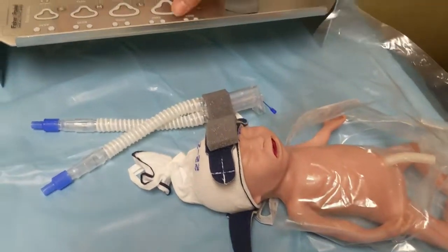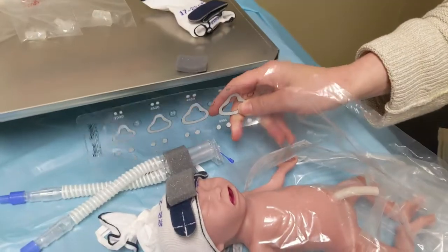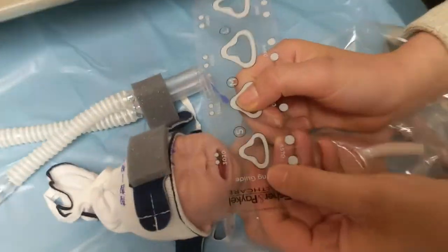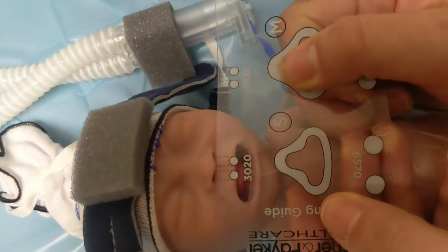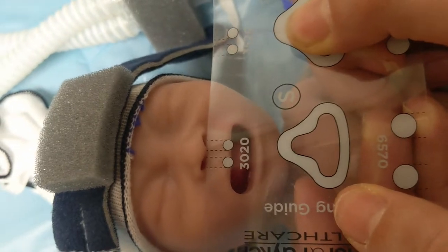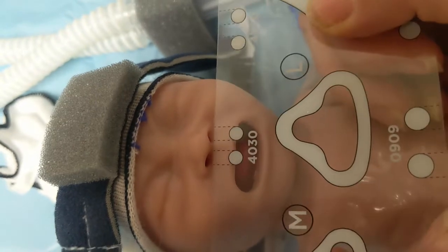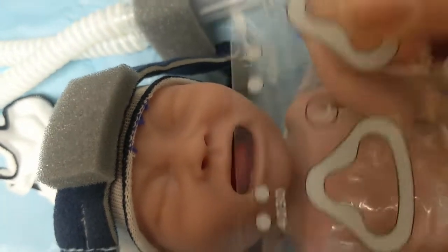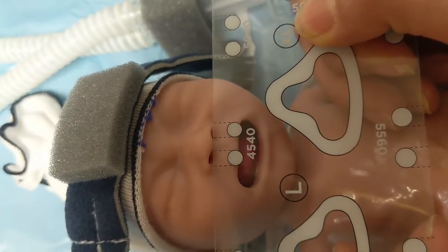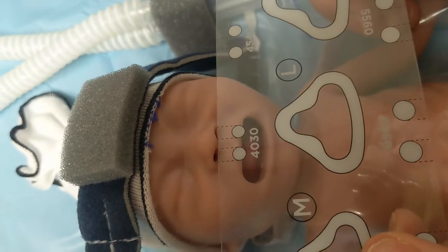The next thing we do is find our prong size. Each nasal tubing kit comes with one of these prong sizers, and I'll show you how we decide. I go and just see: are these dotted lines going to the inside of the nose? Yes. Then I'll go up — yes, we're still inside. No — see how we're just outside of the inner diameter of that nostril. So we go back one where we still fit, and that's our size.